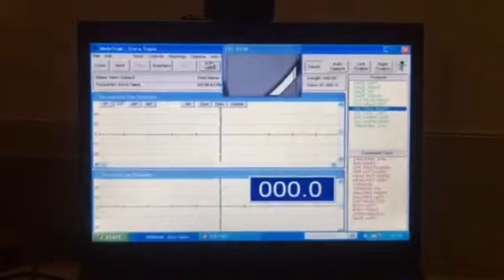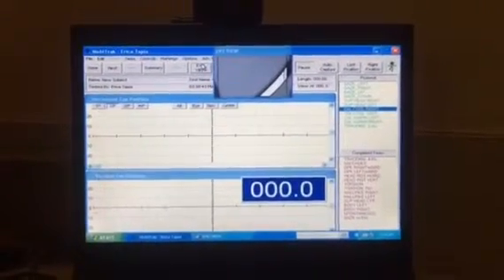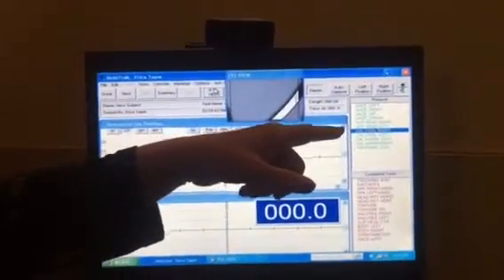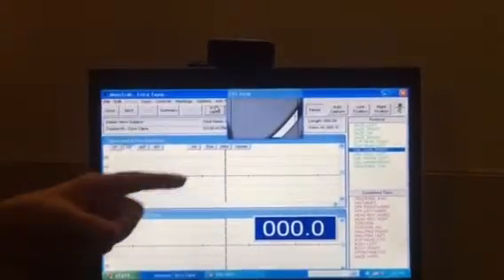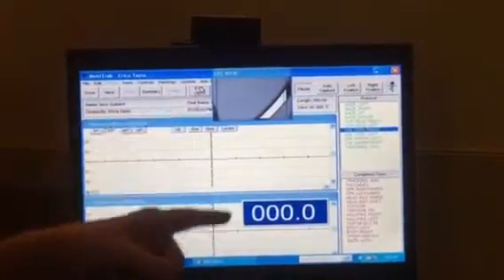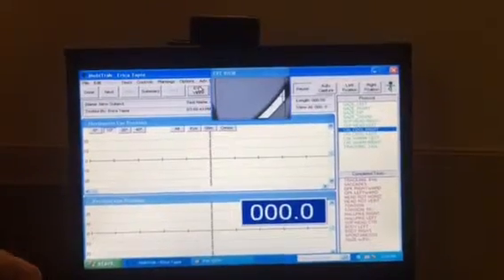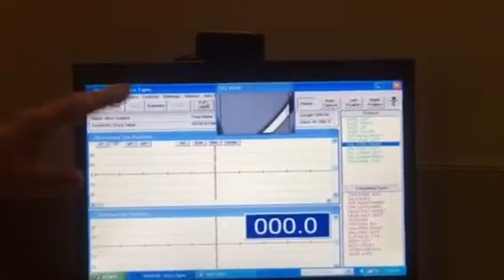Then we do the calorics. Make sure you can see a clear view of the eardrum because you are going to be cooling off the fluid behind it on both sides, and you're going to be warming up the fluid behind it. You have to see the eye dance. If it doesn't dance, you did it wrong or your patient is dead. Okay? So that's what you're going to do.